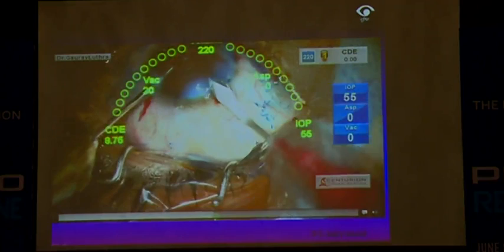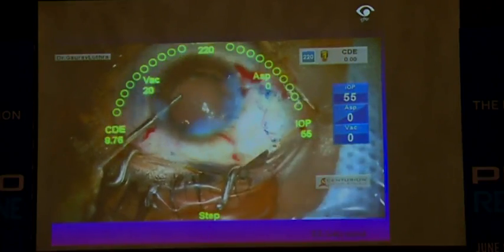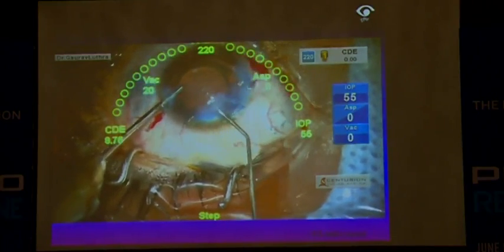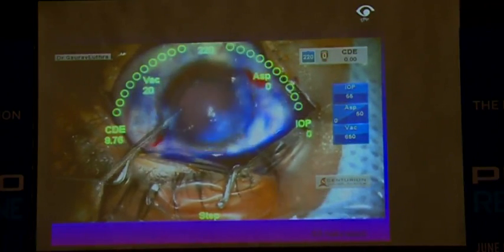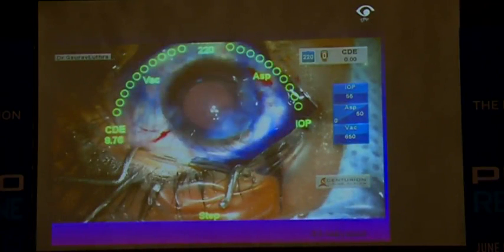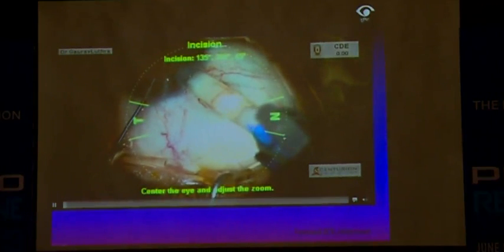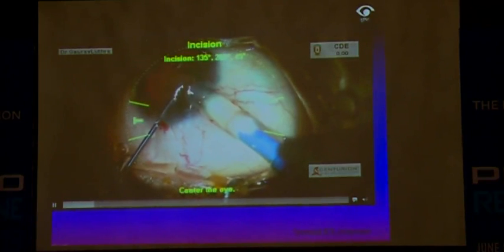So here I'm just going slightly anterior to that original wound and just creating a pocket here, and then I'm just going to hydrate the pocket. So you don't need to struggle in sealing your wound by going on all sides, and you can see that now it's nicely sealed. It just takes a few seconds and it really works well. Even in pediatric cataract, if you want to seal the wound nicely, you can just make this supra-incisional tunnel. It works extremely well.